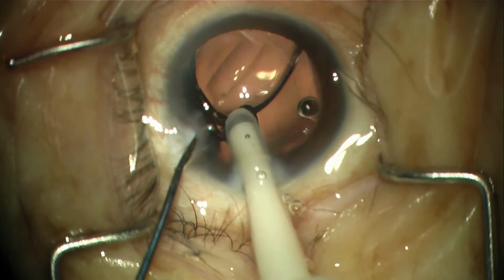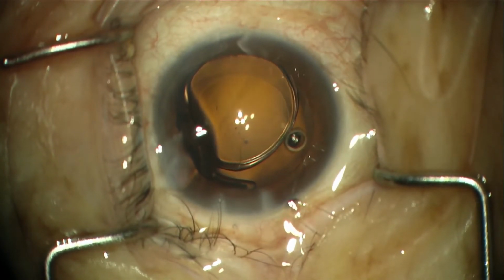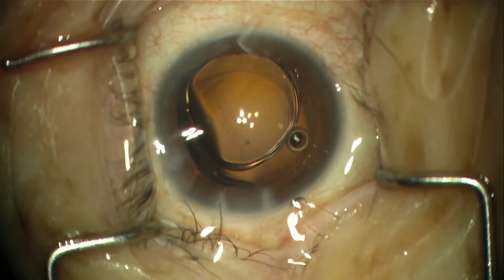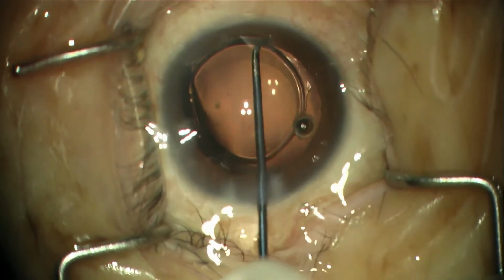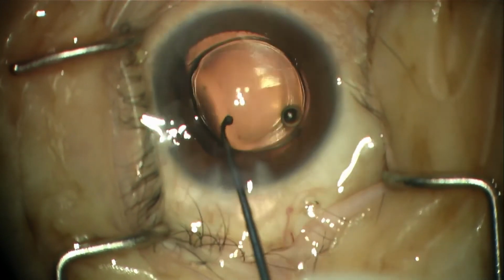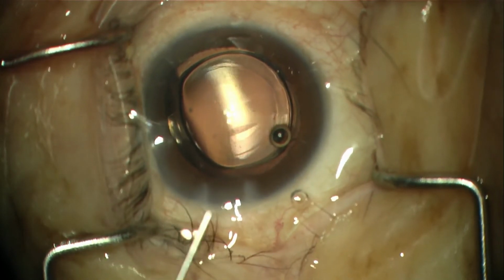We can see the controlled insertion, and the lens is already in the bag, so we just need to rotate it. I prefer to have the lens in a vertical orientation for improved stability. Also takes into account that the eye is not completely symmetric.